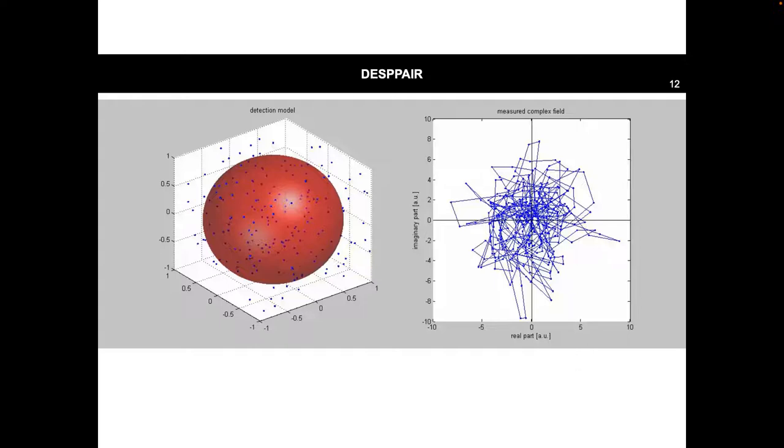And then the phase for this particular location is given by the actual distance that it travels back and forth from a certain plane towards here and back. Ah, yes. So I've defined the plane here. So I know then what the phase is of this particle that comes back relative, because that's all that matters. It's about relative phase to a particle that's slightly deeper that travels a little more back and forth. So I use my Gaussian incoming beam in this simulation to determine the amplitude of the electrical field at each of these locations. And that I use as the amplitude of the individual fields for my total sum. I see. And now it makes sense why the phase doesn't change, because it's perpendicular.